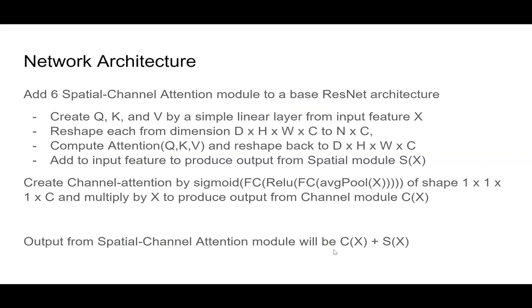Our network architecture involves a novel spatial channel attention module that we add into different layers in the basic ResNet architecture. I explained the spatial piece in my previous paper presentation, UNet R++, if you remember. The spatial piece is a simple spatial attention.